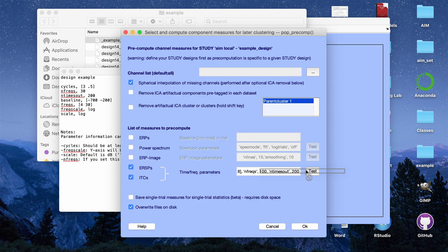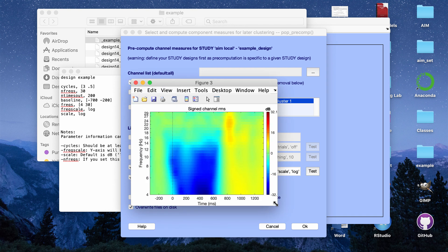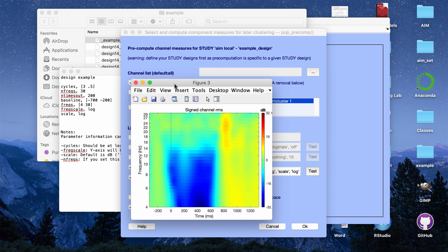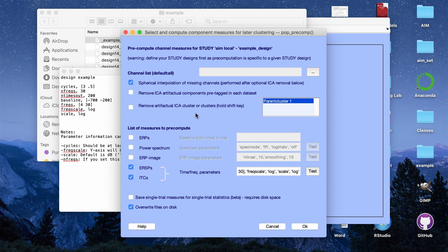I'll go ahead and input those parameters: cycles 3 to 0.5, number of frequencies 30, number of times out 200. If you type something wrong, clicking Test will show an error. After entering baseline and frequency scale, I click Test to confirm everything is typed correctly — and it looks correct. The time frequency plots will have log scaling on the y-axis, frequencies from 4 to 30 Hz, 200 time points, and decibel power.